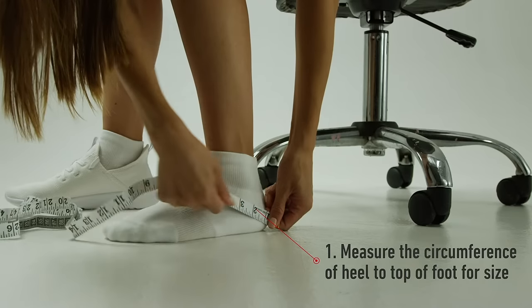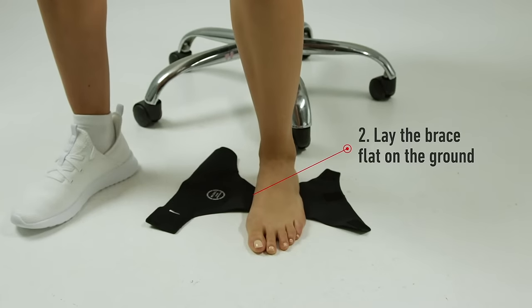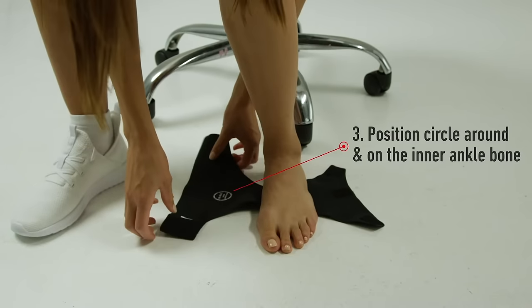To select your size, measure the circumference from your heel to the top of your foot. Lay the brace flat and opened on the ground. Match the inner circle onto your inner ankle bone.